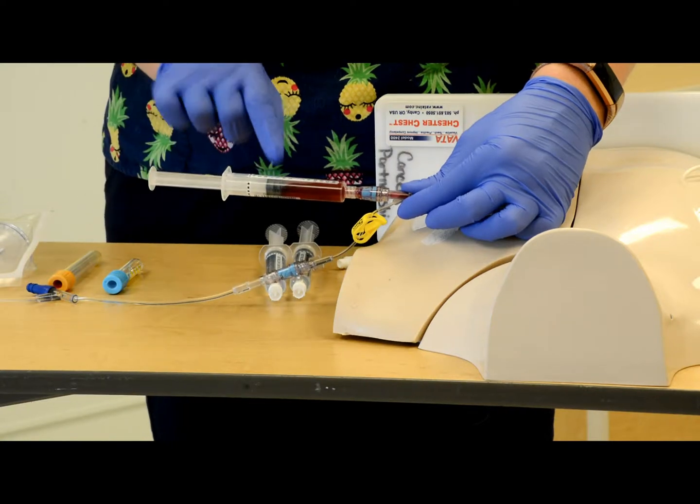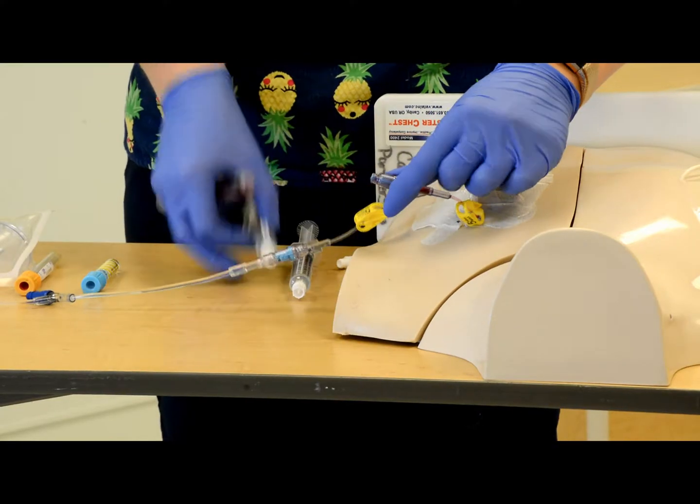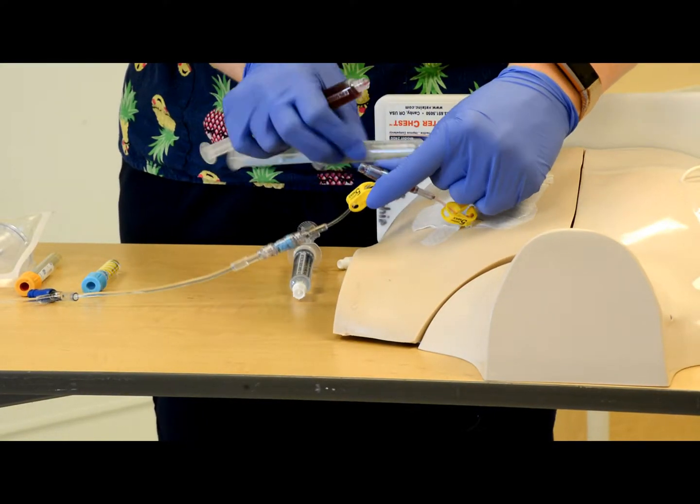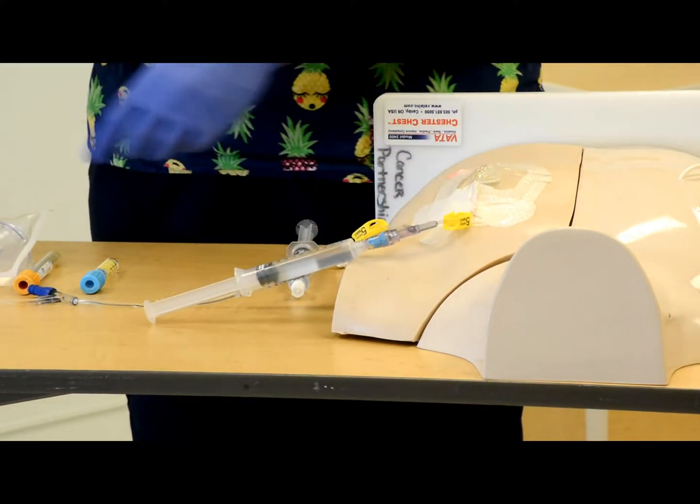Now that I've got my appropriate volume of blood for my tubes, I'm going to unhook this. And I like to put my saline on right away, so I don't have to re-scrub the hub, and just give it a little flush to immediately clear the line.